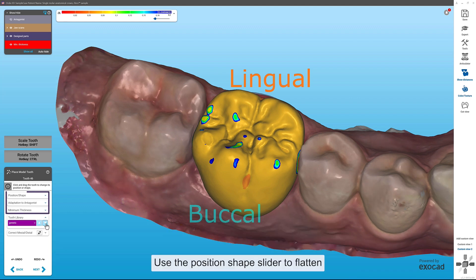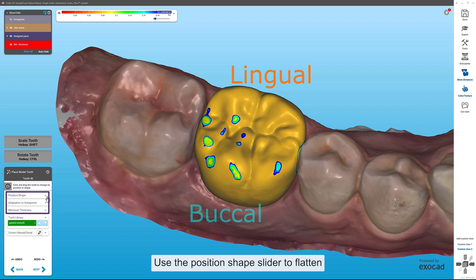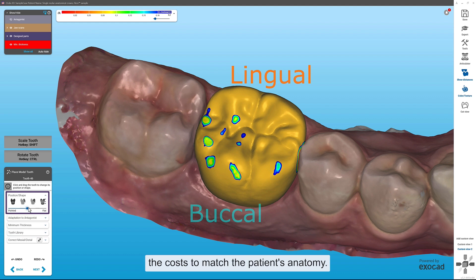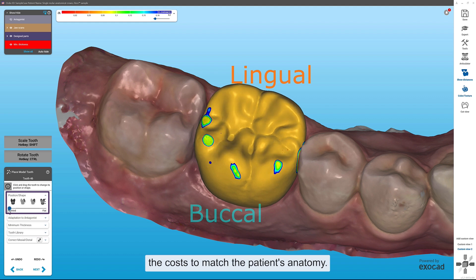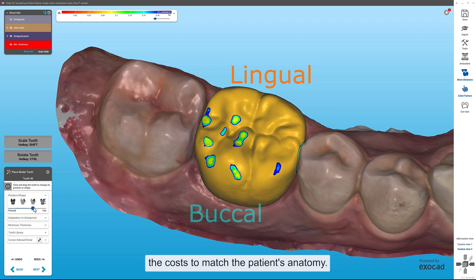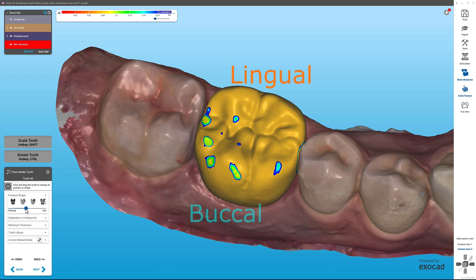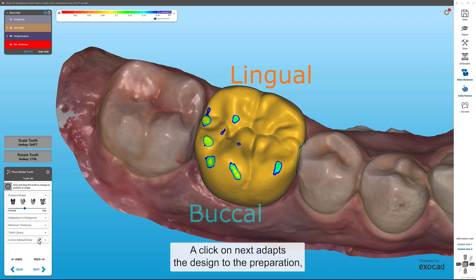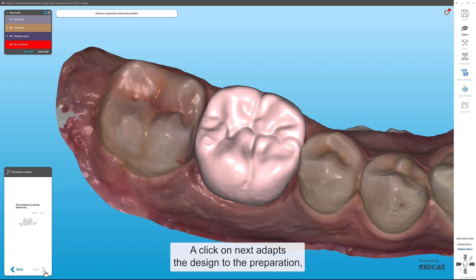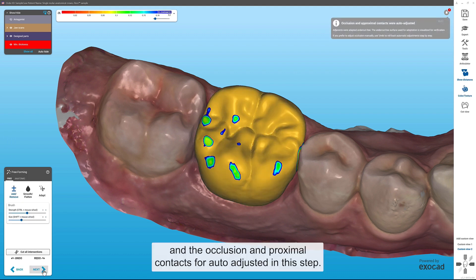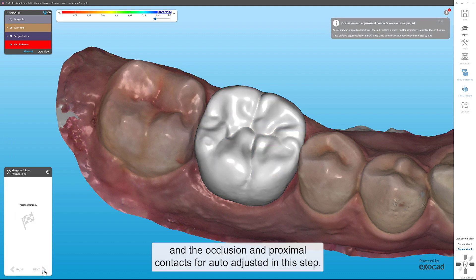Use the Position Shape slider to flatten the cusps to match the patient's anatomy. A click on Next adapts the design to the preparation, and the occlusion and proximal contacts are auto-adjusted in this step.